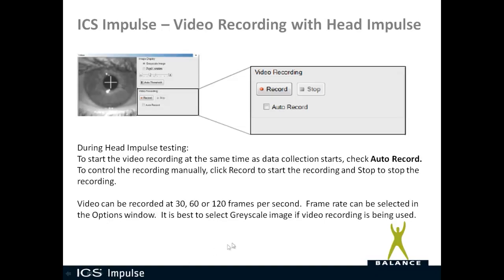During this ICS Impulse video, we're going to talk about video recording and specifically the video recording options in OtoSuite V. You can do video recording during head impulse testing.